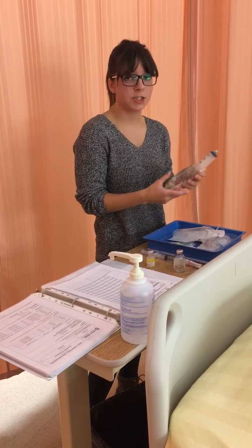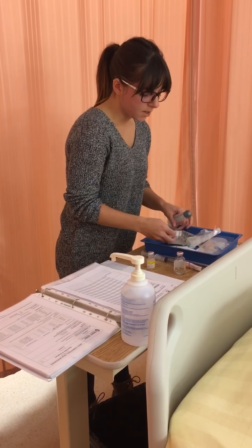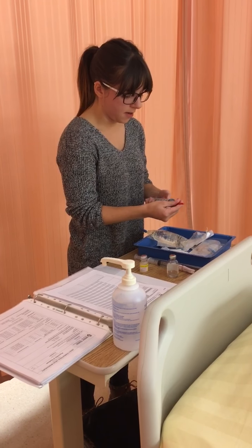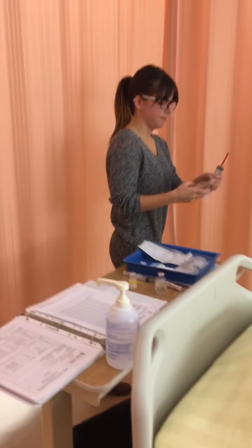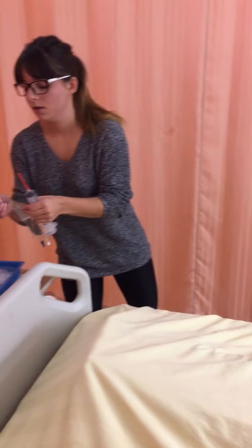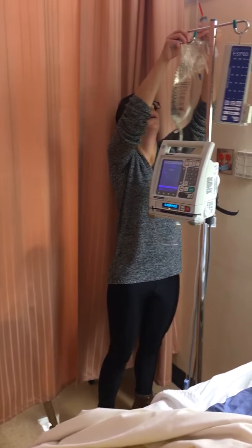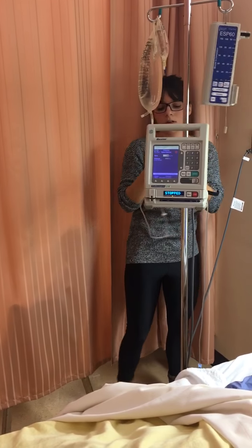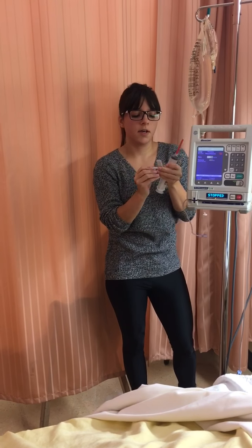That's just because it's such a high concentration, so it's a lot easier than grabbing it from one of these vials. In a real situation, I would have the pole close to me and not inside the patient's bedside here. Hanging an IV pole helps make it a lot easier to withdraw the medication. So I'm going to want to make sure that I swab the end of the mini bag.